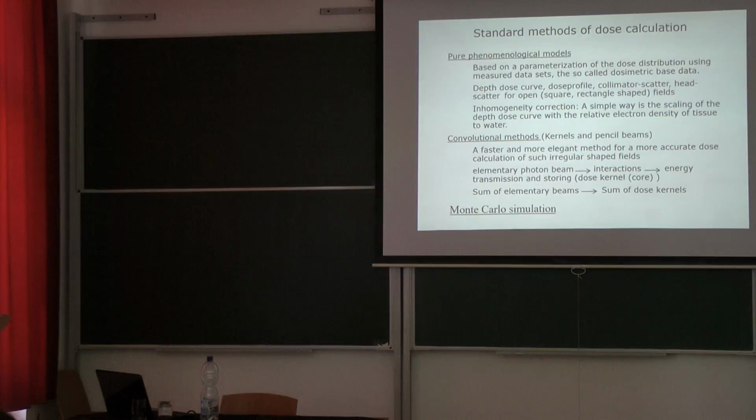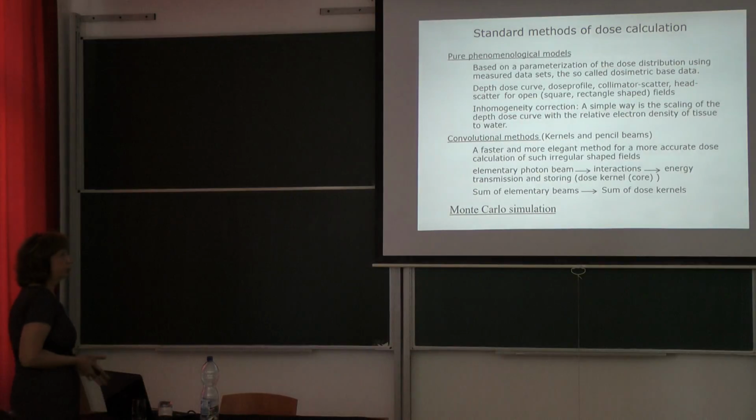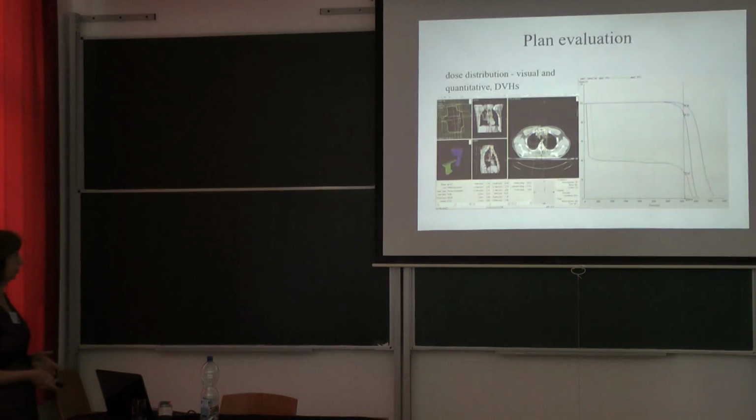And the standard method of calculation is a phenomenological approach, and the convolutional methods, pencil beam calculation or collapsed cone calculation, and most advanced is the Monte Carlo simulation, which really calculates each atomic reaction if we define the material composition.